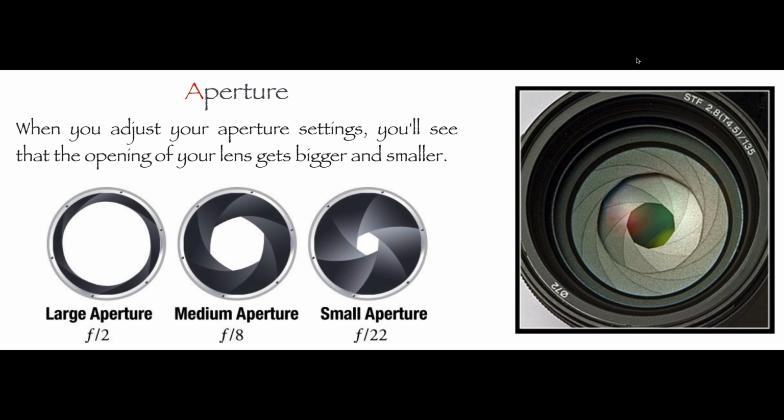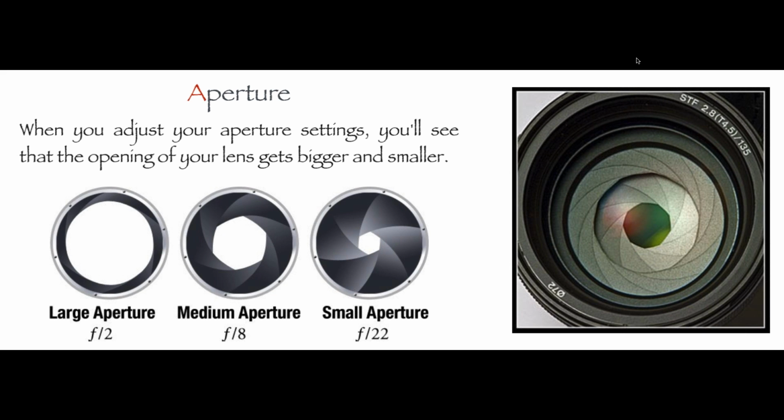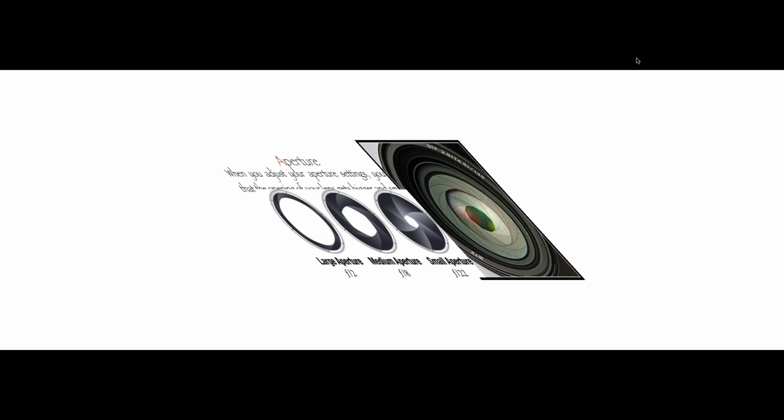When would you use a very low f-stop? You will use a very low f-stop if you have very bad lighting conditions in the area where you're going to take the photo. So now I'm going to ask you, when you're doing dental photography, when you're doing intraoral photos, do you have any lighting problems? No, because you either have a ring flash or you have a dual point flash. So you have light that is being emitted directly to the area that you're going to be taking the photo from. So you will never use in intraoral photography either f2 or f8.